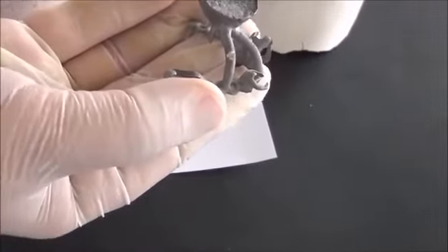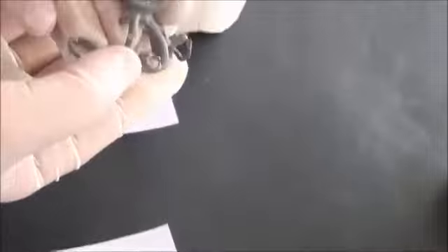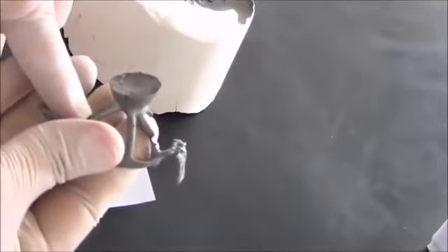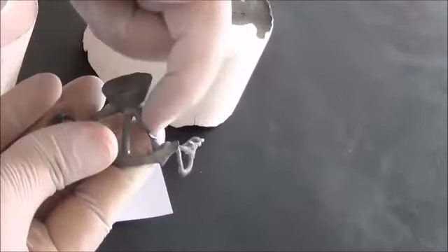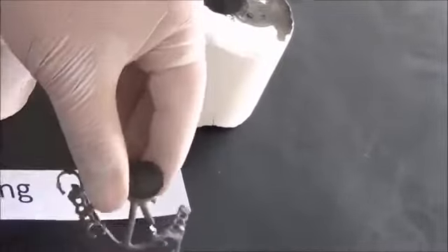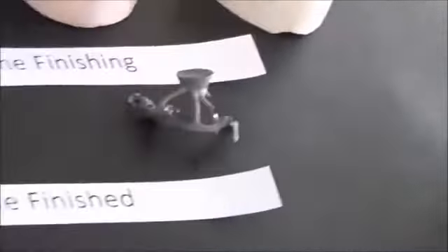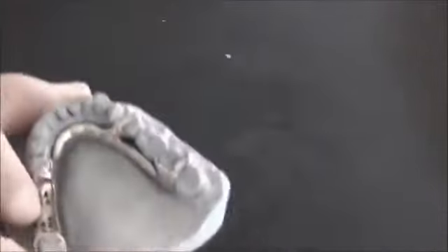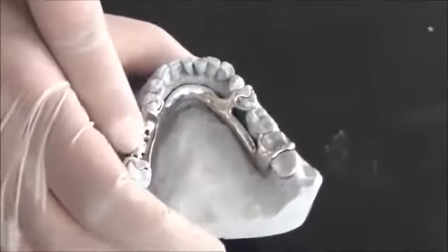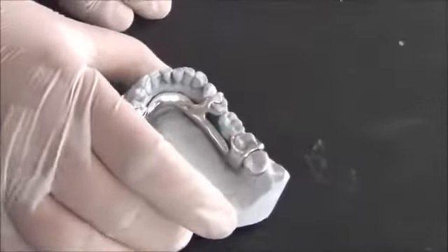previously in wax. To finish this off, remember that these are not components that I'm going to place inside the patient's mouth, so we need to cut them off. We begin by cutting with specific discs. After cutting, we begin finishing them until they become totally smooth. And the metal is polished. This metal framework is now ready to go to the clinic.